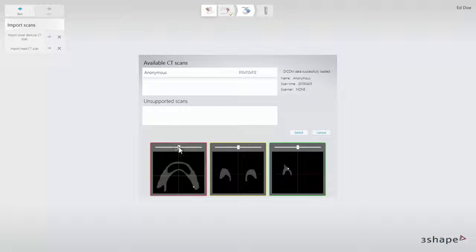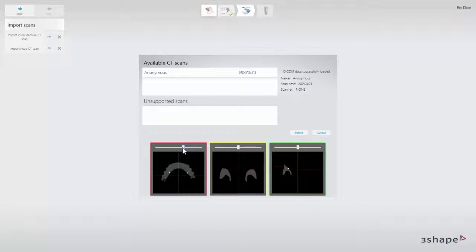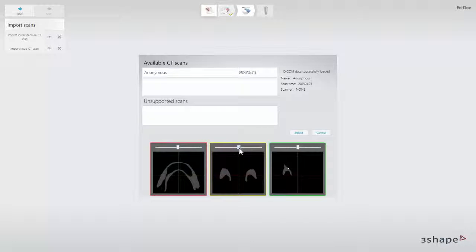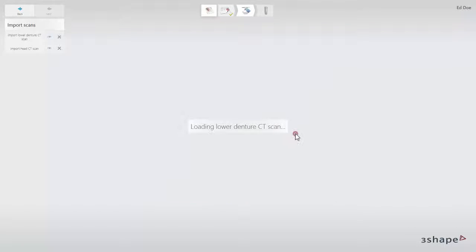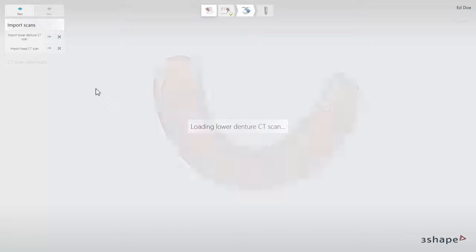Using the sliders, scroll through the content in the 2D cross-section. Click Select to load the scan. The 3D preview of the denture will appear on the screen.